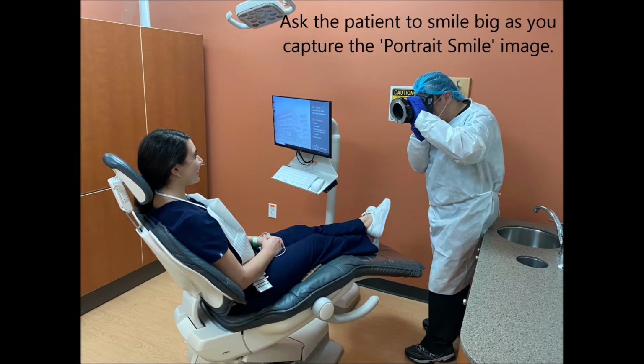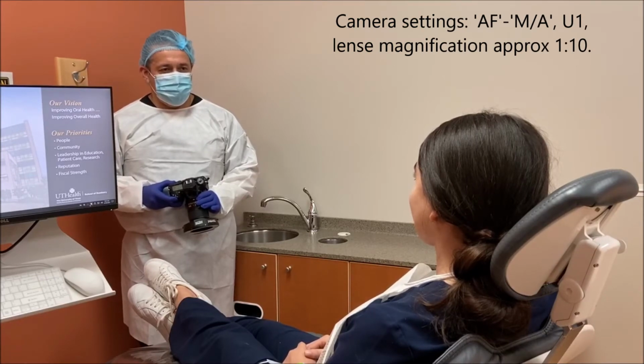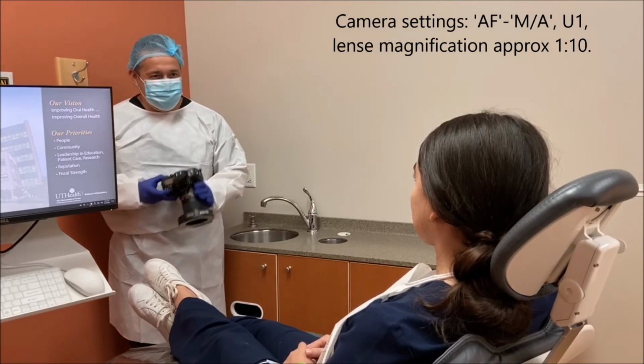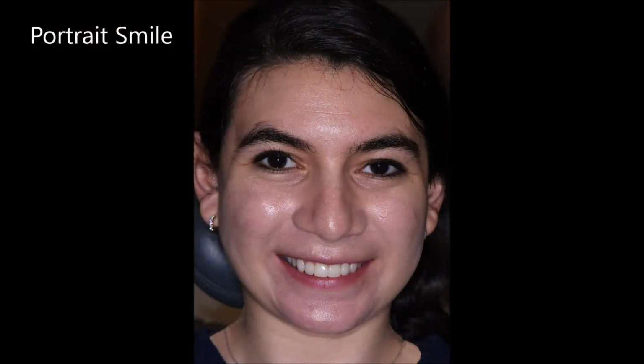Clinical photography protocol. Ask the patient to smile big as you capture the portrait smile image. Camera settings, AF, MA, U1, lens magnification 1:10. Portrait smile.